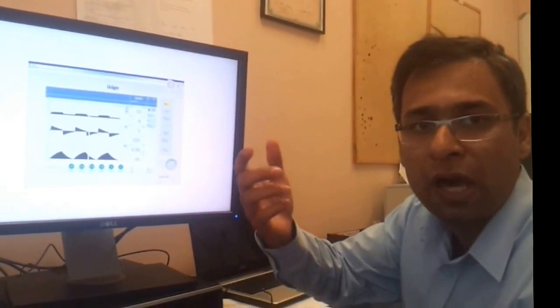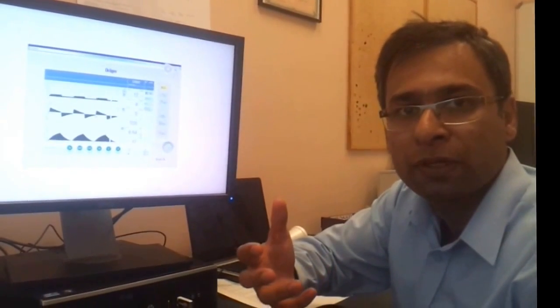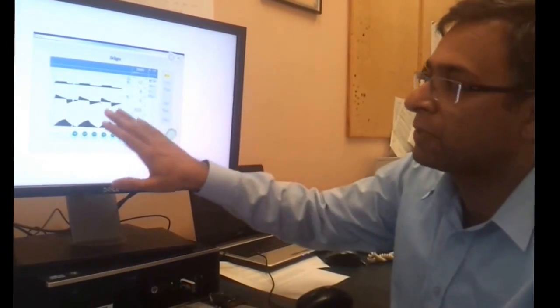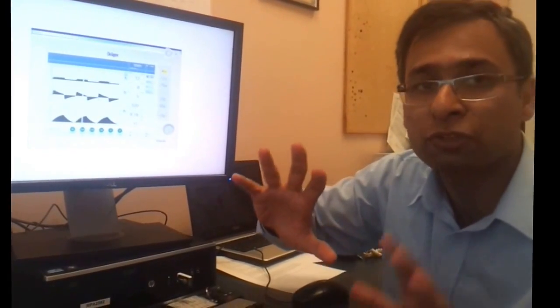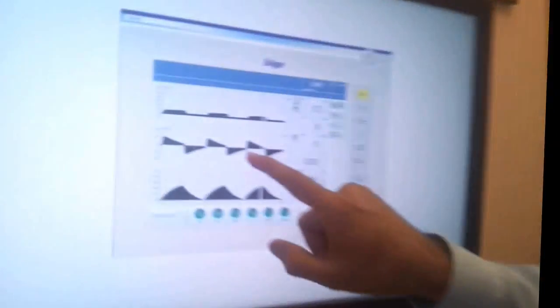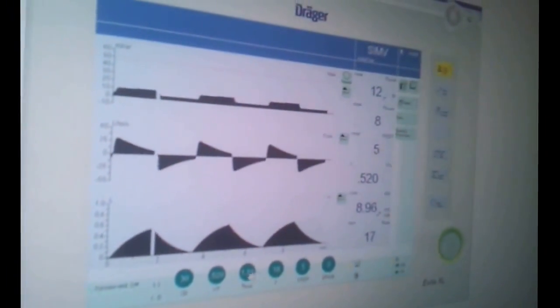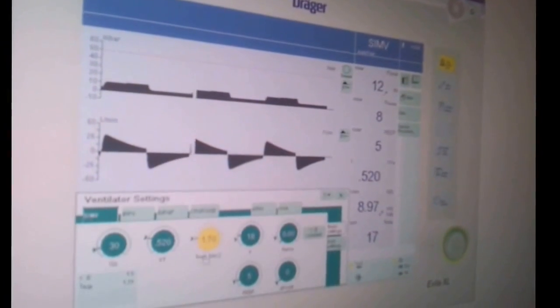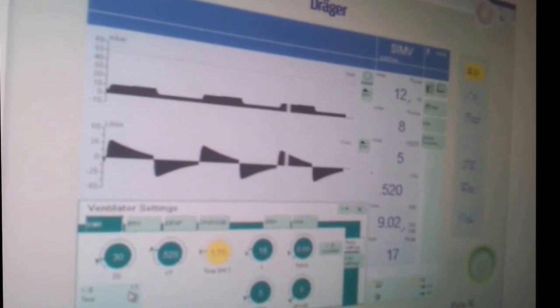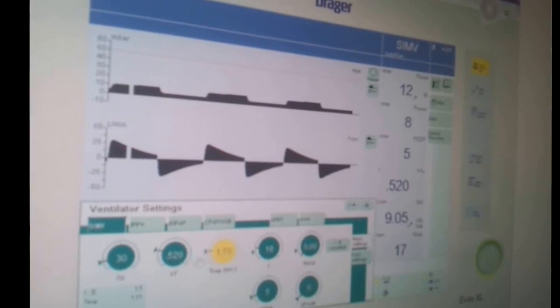And in asthmatic people, they will have auto-PEEP as well. And we'll talk about PEEP in a moment, but just for normal ventilation in a normal lung, we should always have a look at the expiratory flow curve. It should always finish. Now, how could we make this finish in time? What we could do is decrease the time inspired. So if you see the time inspired here is 1.7 and the IE ratio is 1:1, which is usually bad. So we should decrease the time inspired.